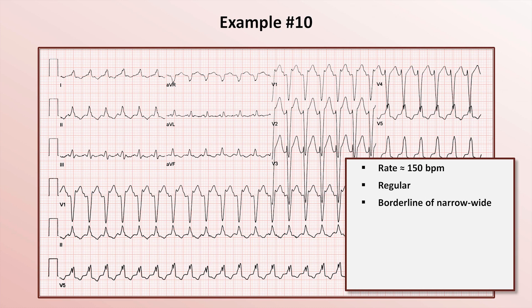So maybe this is just sinus tachycardia with a borderline wide QRS due to a left bundle branch block — we saw that a few examples ago. But let's zoom in on V1.